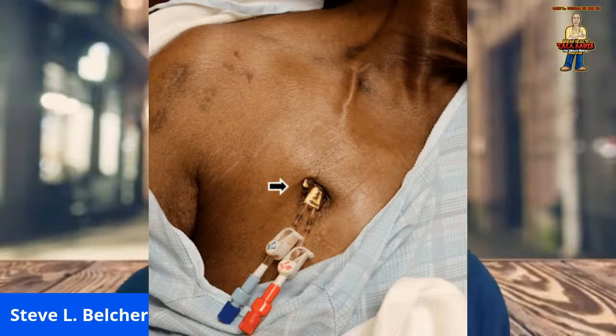What about infection? Infection can also occur even with a good blood flow rate. It is important to follow your catheter care instructions exactly as you were taught in order to avoid infection. You should know the following signs and symptoms of a catheter infection and report them to your doctor or dialysis team right away so you can get the proper treatment as quickly as possible.